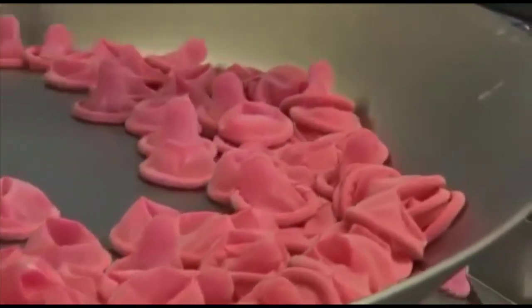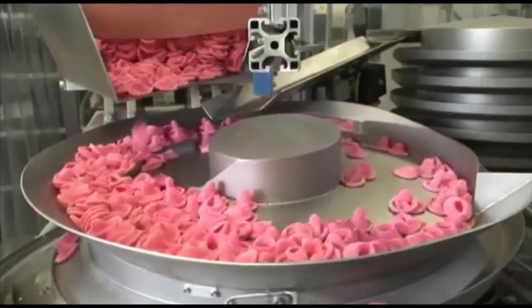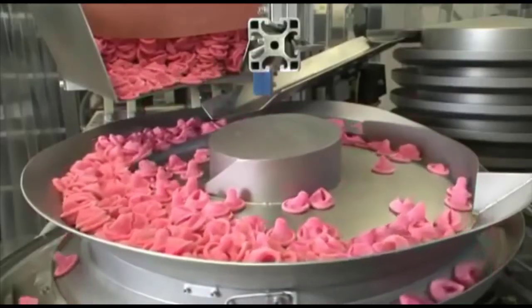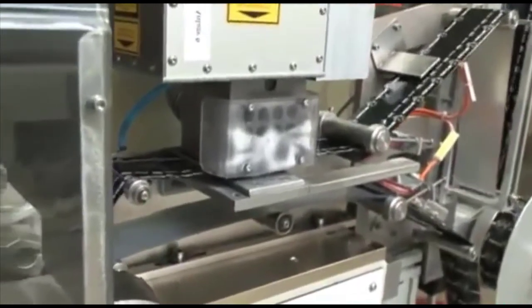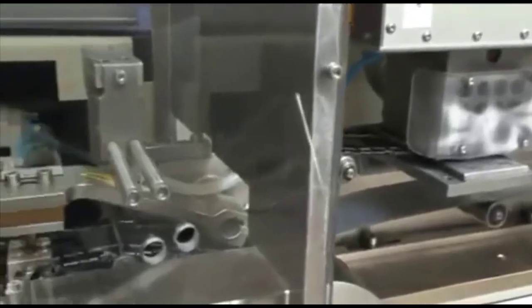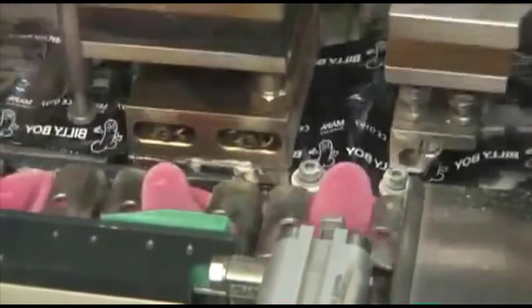Once tested and rolled up, the condoms can now be wrapped into their primary wrappers. Each condom is fully-automatically sealed airtight into its own sealing foil. Here, each condom type also receives its specific lubricated coating and aromatic flavor.